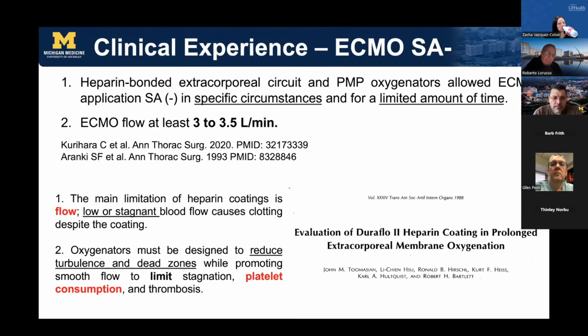So the most important thing here is heparin coating. The main issue is flows or design of the devices that create clotting. And then, once you fix all of that, you need to smooth the stagnation of the flow and then prevent platelet consumption and therefore thrombosis.